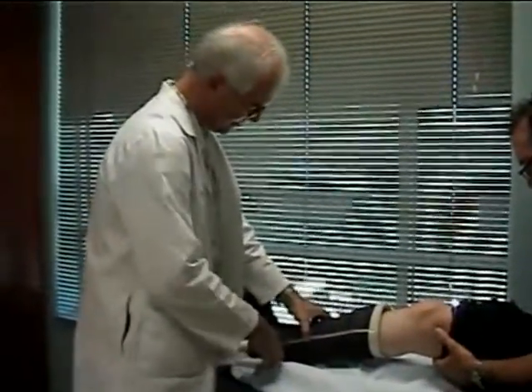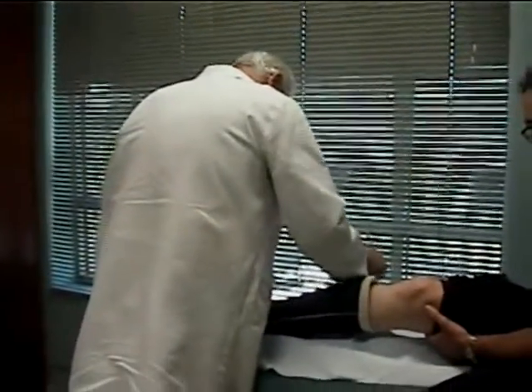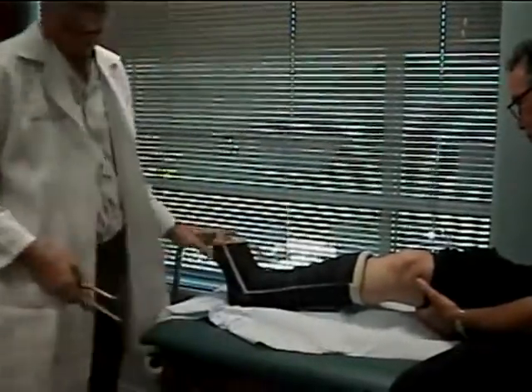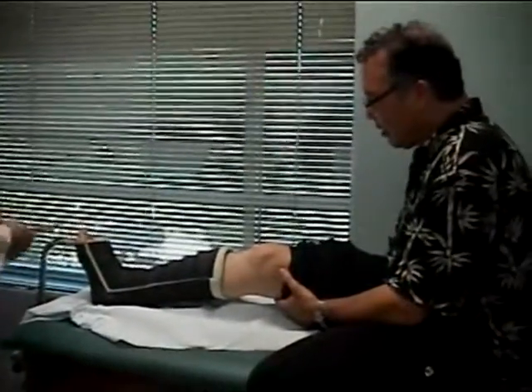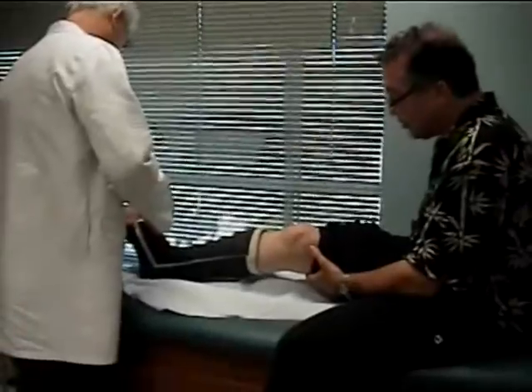The key is to record the procedure. Right now they're taking the cast off that's been on my leg, the lower part of the leg, for about six weeks.